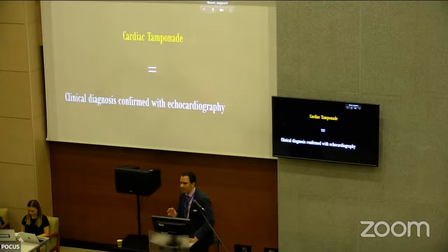And you cannot rule out pericardial collection using transthoracic echo, especially after cardiac surgery. And here comes the important role of transesophageal echo, because you can easily miss posterior small collections contributing to cardiac tamponade if you rely on transthoracic echo alone. So very important to be aware of this limitation. And that's the end of my presentation, Alessandra.